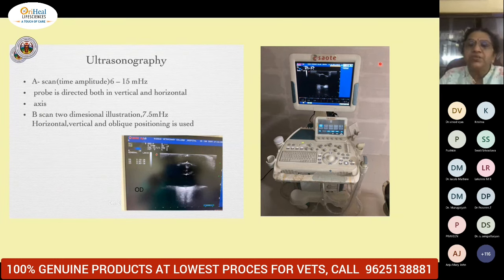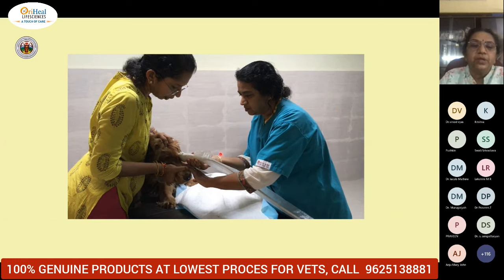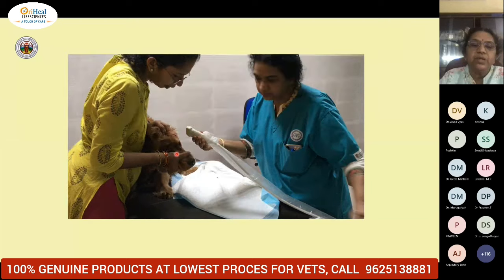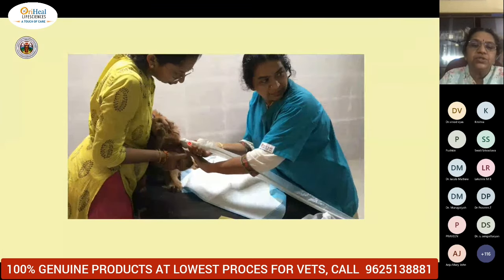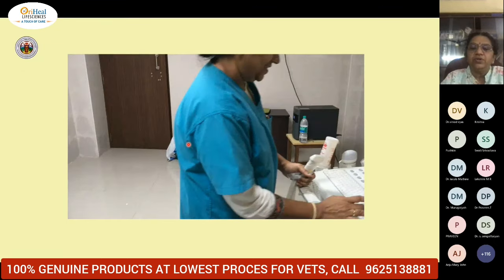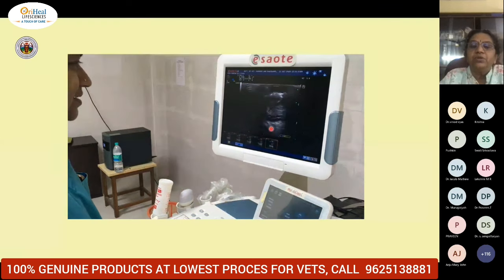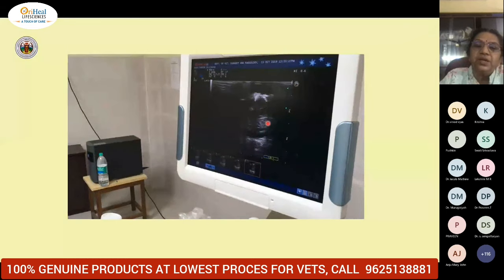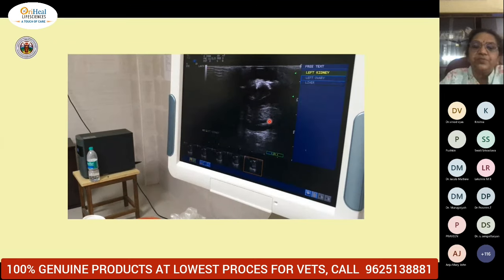This is the machine we use here for ocular B-mode ultrasound, and you can see the probe placed on the animal. Here the probe is placed vertically, so this is the longitudinal view. If the animal is not cooperating, it is enough to study with the help of the longitudinal view alone. In the longitudinal view itself, you get some readings: this is the lens, and here you can see the vitreous degeneration.